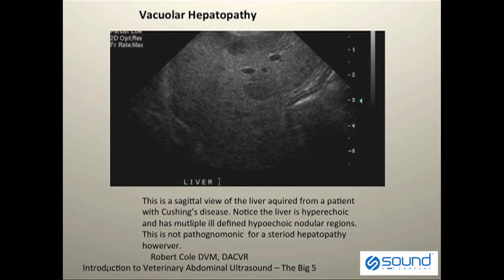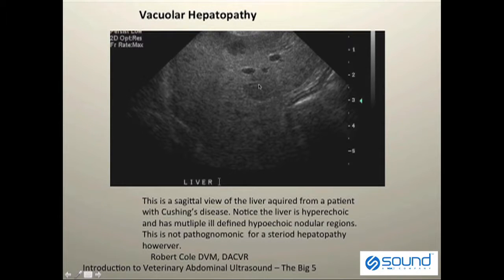This is an example of a common pathology identified in our canine patients, typically referred to as a vacuolar hepatopathy. In this particular image we can see that the liver is uniformly hyperechoic. It's difficult to identify the portal vasculature, and there are multiple ill-defined hypoechoic nodules as being outlined on the screen.